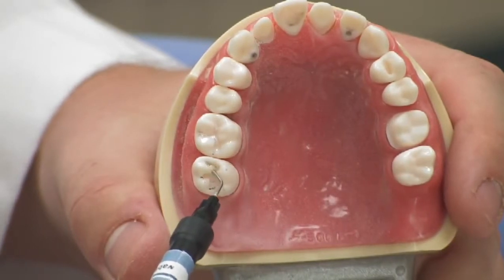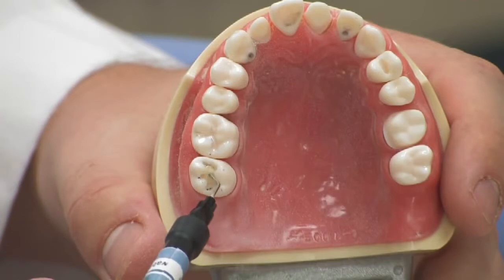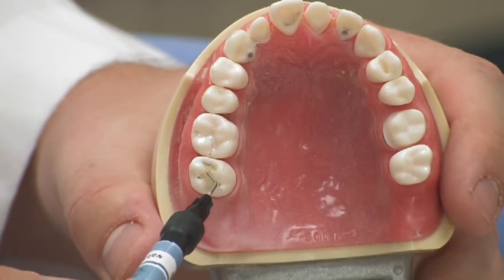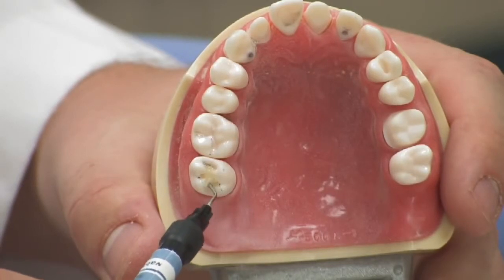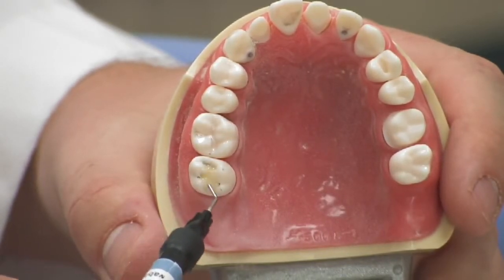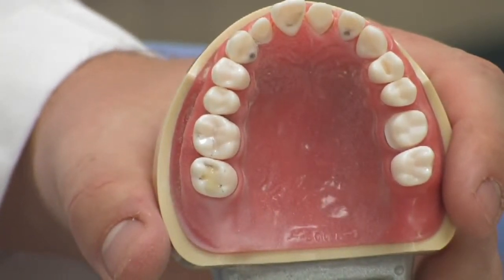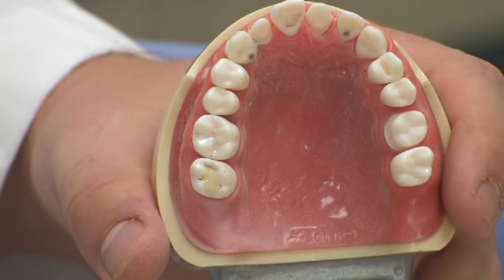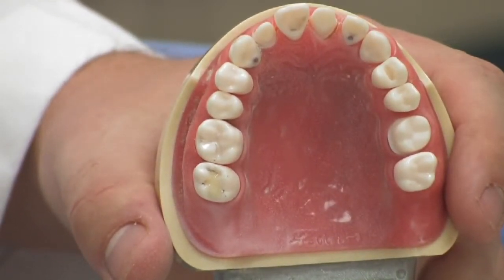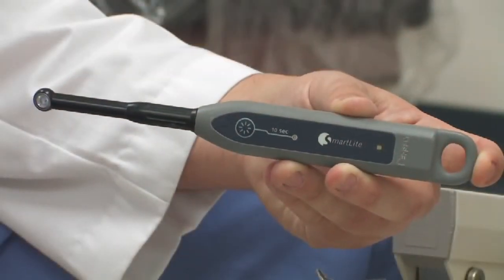Again, it's a tooth-colored material that typically blends very nicely and cleanly. So we're going to go through and lightly put our material right into the tooth. Once we have it filled, we use a special light to set it up. Filling materials start out very soft in order to be able to mold them appropriately to the tooth. Once it's been molded, we use a special light that, when shined on the material, turns it very hard and makes it very strong.